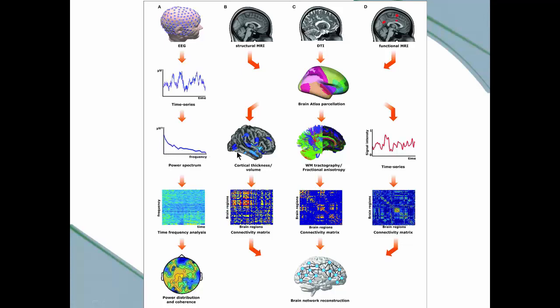So one thing you might consider is, let's say you need to change the relative ratio of these waves. You could use some sort of a feedback or retraining process by which this power spectrum density curve is changed over time, and this is what we're going to try to do as well.